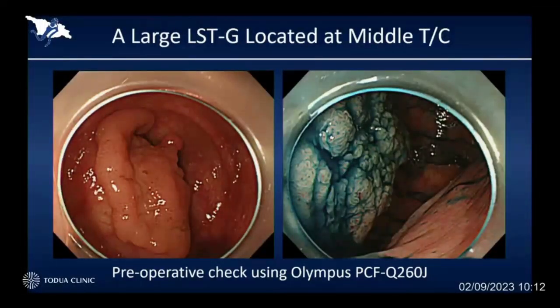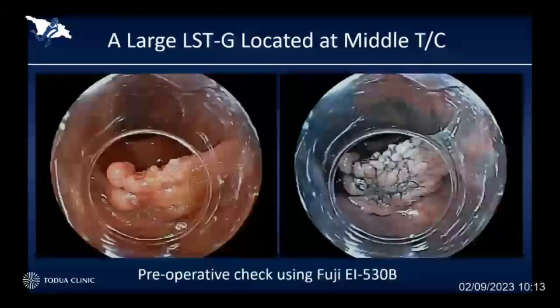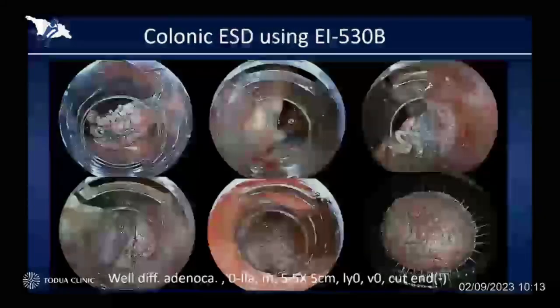Therefore, we decided to use the double balloon overtube system to access the difficult area. Fuji already developed this short-length double balloon system, which we can use for the colorectal ESD procedure. By using this Fuji double balloon system, I could easily go behind the target lesion. As a result of having smooth maneuverability, I could conduct ESD very smoothly even in this very difficult situation, and finally achieved curative resection and avoided unnecessary surgery for this patient.